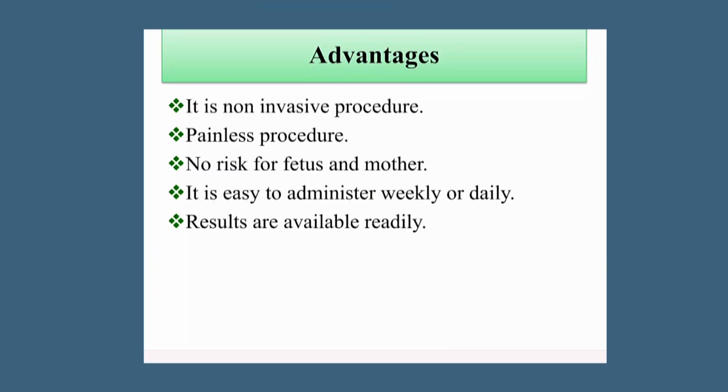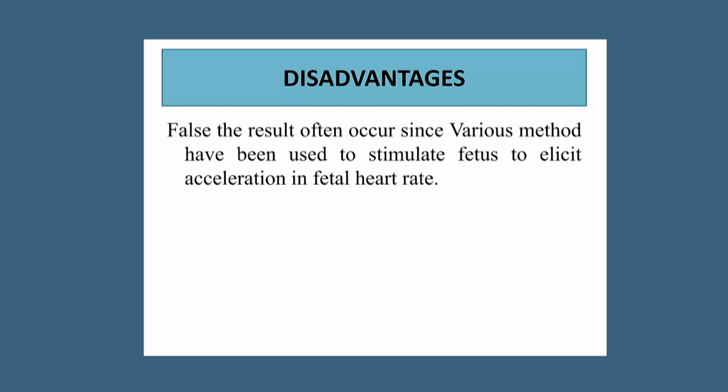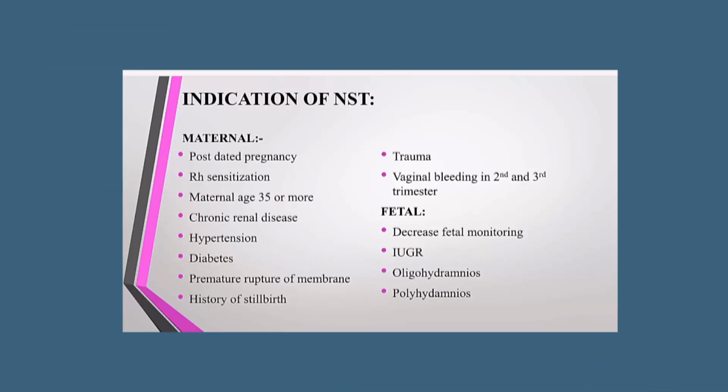Next, we'll discuss the advantages and disadvantages of the non-stress test. First we'll see the advantages. It is a non-invasive, painless procedure, with no risk for fetus and mother. It is easy to administer weekly or daily, and results are available readily. Next are the disadvantages. False results often occur, since various methods have been used to stimulate the fetus to elicit acceleration in fetal heart rate.